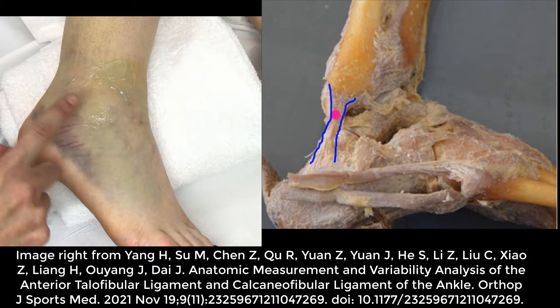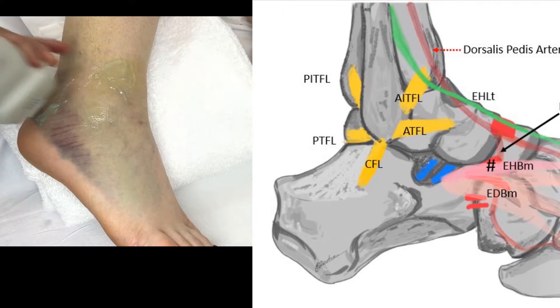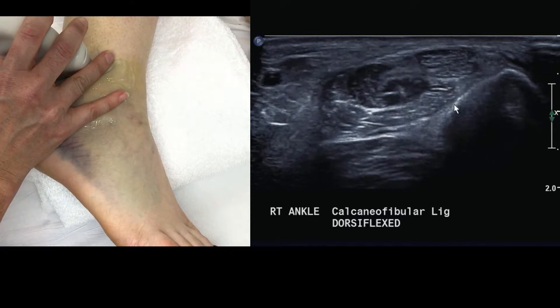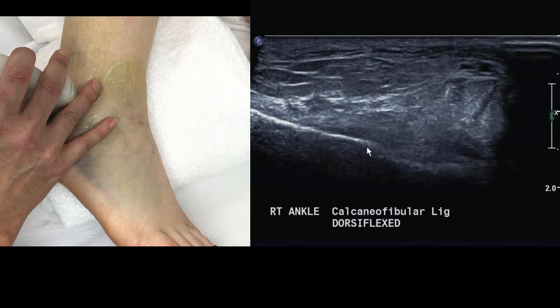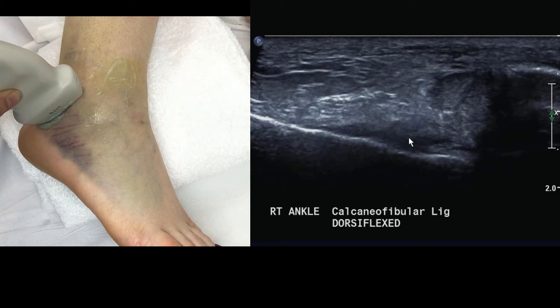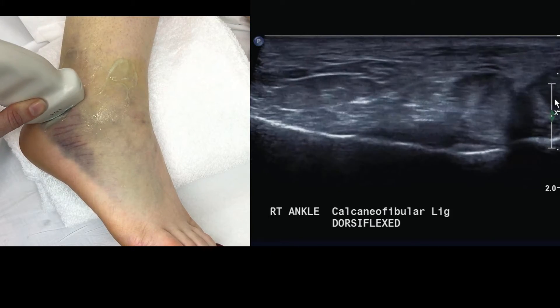In the lateral ligament complex, ATFL is done. Now moving on to the calcaneofibular ligament, or CFL. To find it, aim the probe at the midpoint between the heel and the lateral malleolus. You can also follow the peroneal tendons down and around. The peroneus longus and peroneus brevis are stacked on top of each other over the fibula. The CFL slings like a hammock underneath the peroneal tendons from the calcaneus up to insert on the lateral malleolus. The calcaneal insertion is the most important portion to visualize clearly.